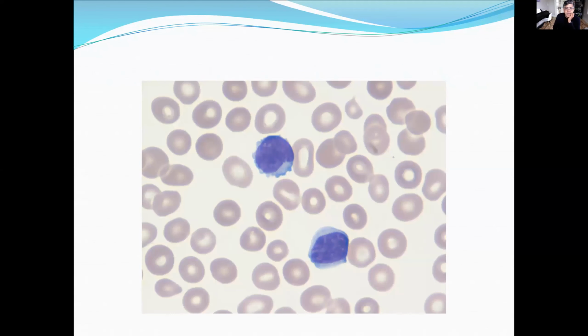And are these lymphocytes or blasts? Anybody? So, okay, these are just lymphocytes. Yeah, mature. Sarah said that. Pratap, Sudarshan, Balaji, wonderful. These are lymphocytes. So, where are the blasts? They've disappeared without any treatment.